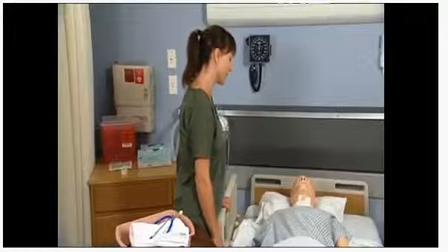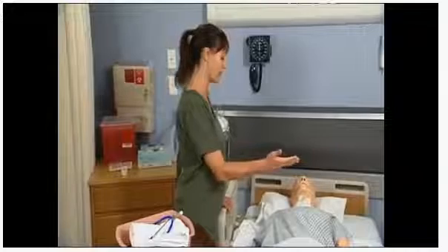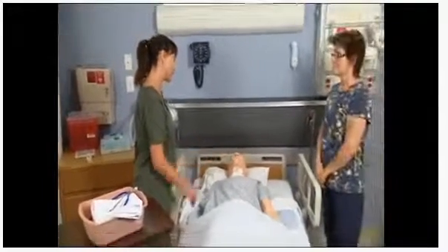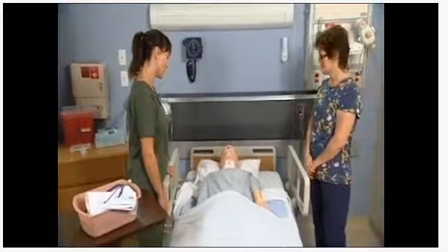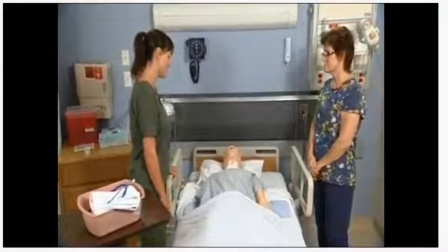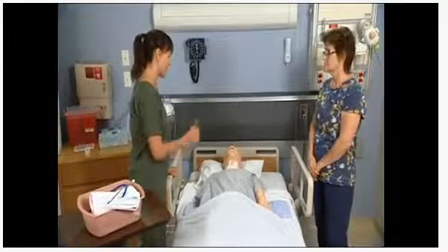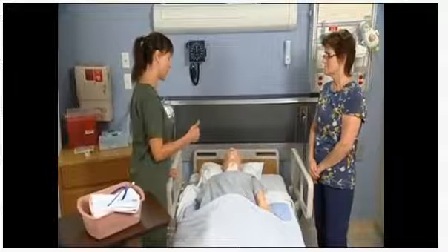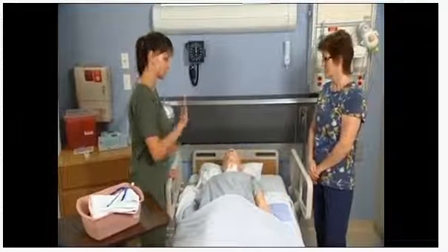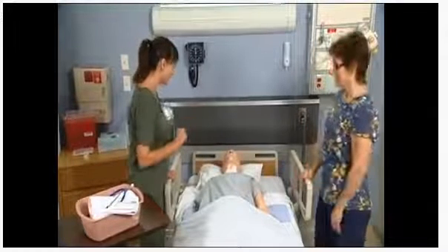It's going to be a little bit uncomfortable while I'm doing this, but I have an assistant here, and this is Deborah, and she's also going to be helping out as well. A couple of things that I need to go over with you at the beginning, Mrs. Jones, is that during this time, you're going to feel like you can't speak, but you should be able to talk. But let's go ahead and develop some hand signals, okay? Why don't we do a thumbs up if I ask you if you're okay, a thumbs down if you're not okay, and if you need me to stop at any time, why don't you just put your hand up as in stop, okay?